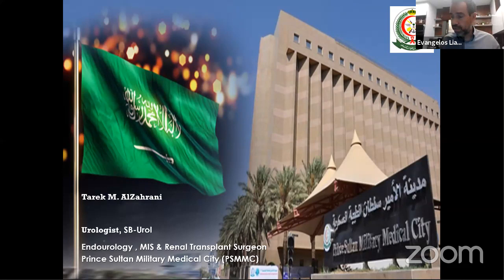Malecot at the end of the case: the malecot does not tamponade. No tube is tamponading at the end, so the tamponade is not an effect that the tube is doing. The reason we use malecot in some cases, and I will explain the variety afterwards, is that some of our patients come from far away. They come from places that do not have access to urologists. So if we put a double J stent, they would have to go somewhere afterwards to take it out. By using a malecot, you keep it in the patient for 3 days, but then you pull the malecot tail out and the patient has nothing in. This is the reason we use the malecot.